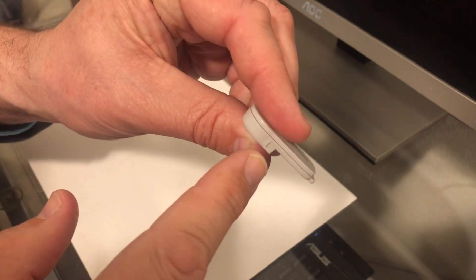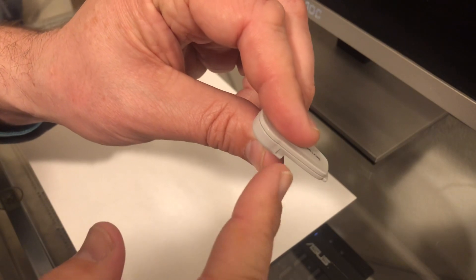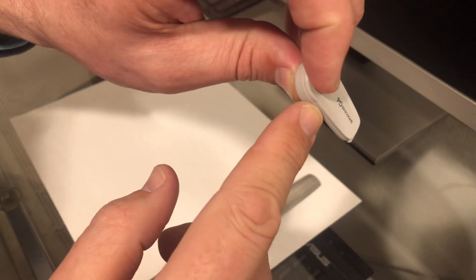At the bottom is where it clips in, and at the top is where you're going to want to slide in a credit card, butter knife, or — I like to use a toothpick. We're going to make a little notch right here with a file, right above the notch. You don't want to file the notch off — you're going to file the top side, right here.